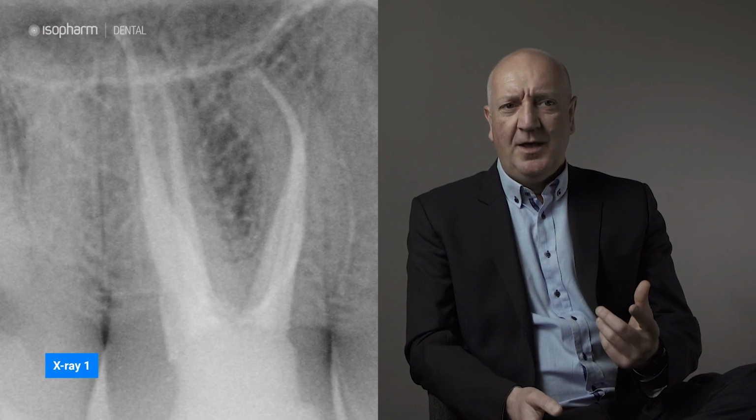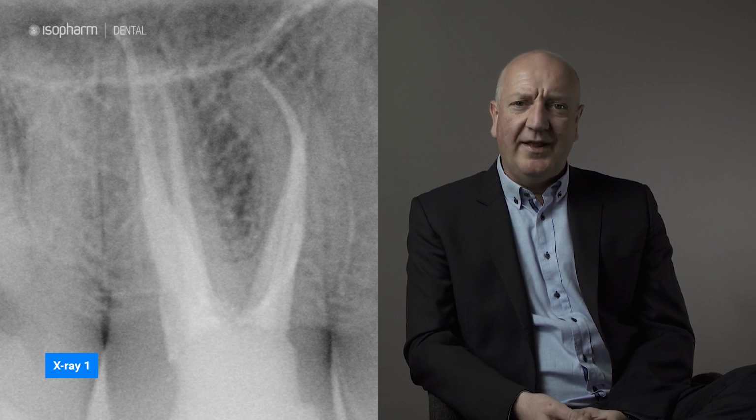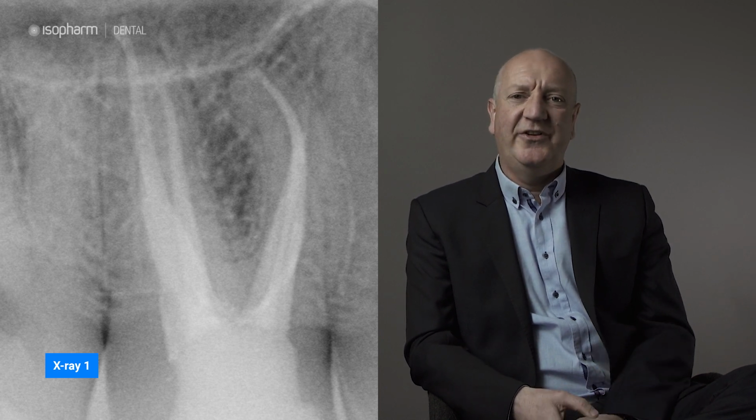Obviously, we know that there are certain areas of the mouth where a periapical can be quite difficult to interpret. Lower incisors, for instance, there's no one root canal, or there are two root canals in that lower incisor. Upper sixes and upper sevens are the absolute classic, where it can be very difficult to establish a diagnosis just from an X-ray. This patient is the perfect example. She has a root canal that was performed 6 months ago. General practitioner was perfectly happy with it, but she's persisted in having pain, particularly when she taps the tooth.